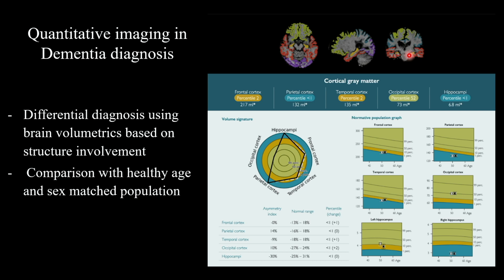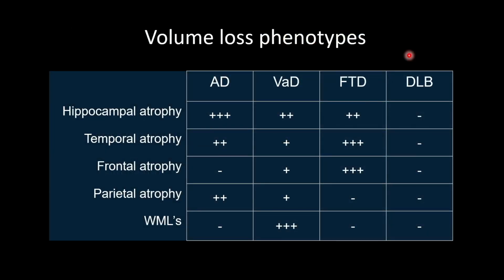conditions. Dr. Johnson talked about using the same quantitative AI-driven tools for following up multiple sclerosis. In this case, you look for brain volumetrics that may point to a certain degenerative brain condition that could be helpful in terms of identifying which dementias there are. In this case, we're looking for the hallmarks of Alzheimer's disease, which would be appropriate for this therapy.